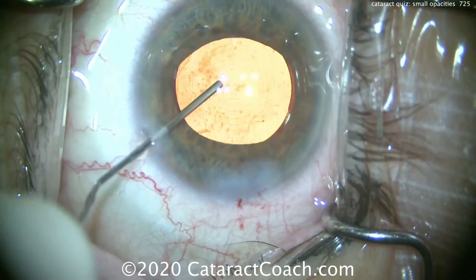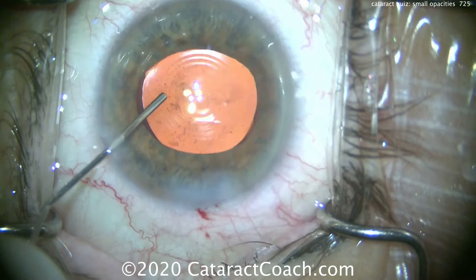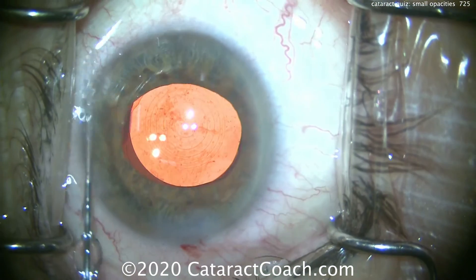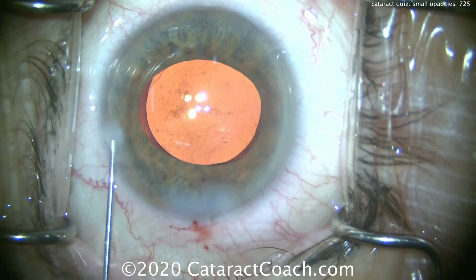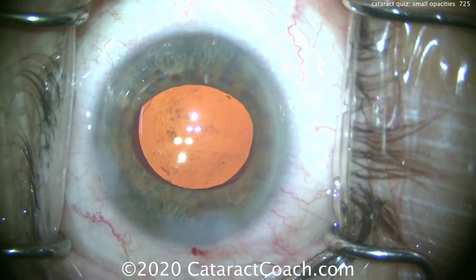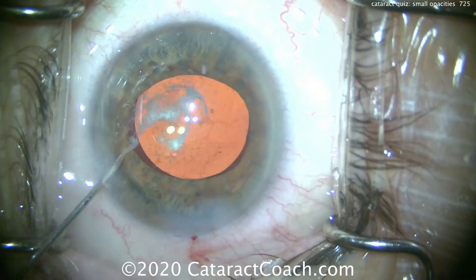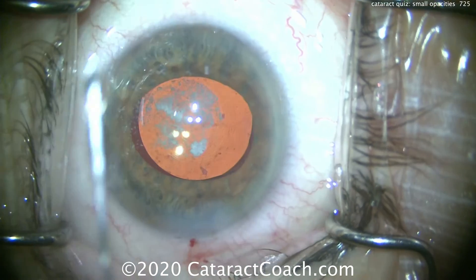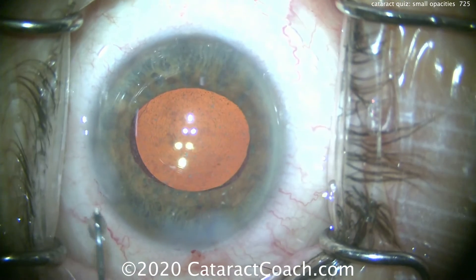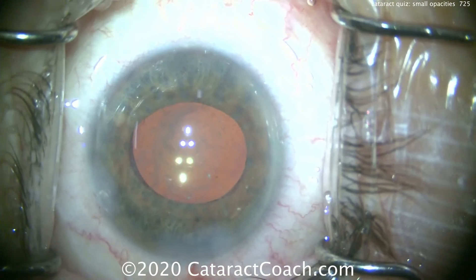On post-op day one when examining this patient at the slit lamp, you really don't see any of those tiny little particles — and they do dissolve over time in the inflammatory cascade, posing no significant issue. It is important to keep the patient on topical NSAIDs and steroids a little bit longer in this case until the eye is truly quiet. So I'll put a little bit of triamcinolone in the anterior chamber at the end of the case, swirl that around, and that's going to help with the initial inflammatory control, though it won't last more than just a few days.